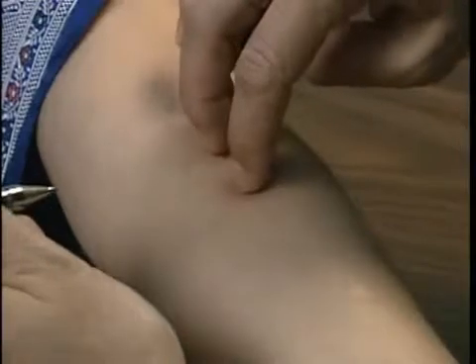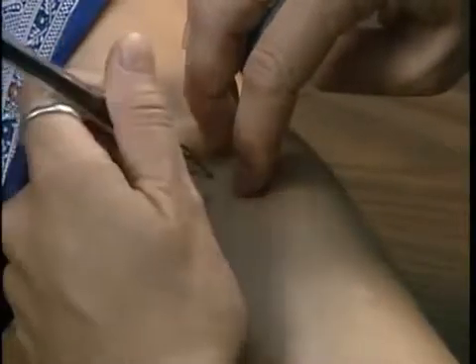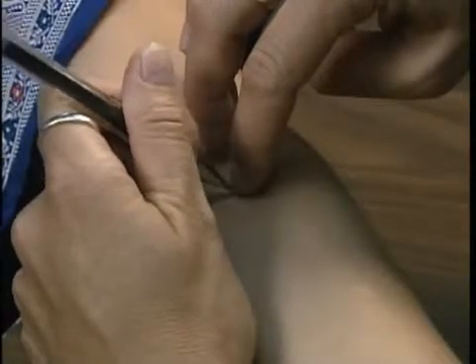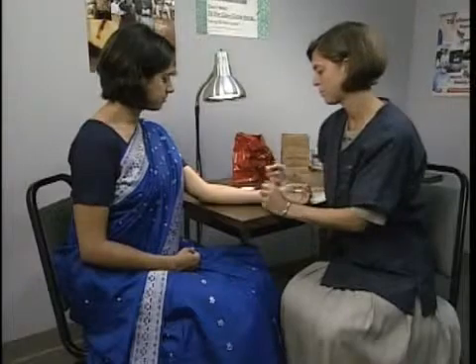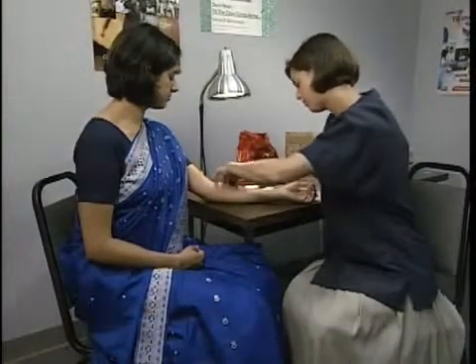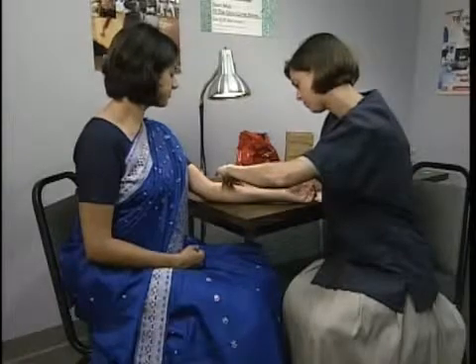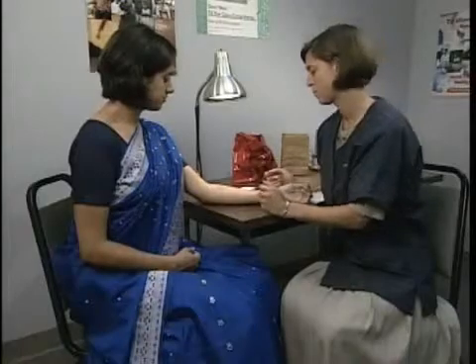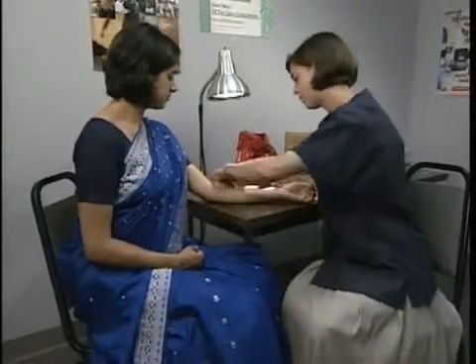The fingertip should remain in contact with the skin at all times. Mark lightly with a fine dot at the widest edge of the induration, using the fingertip as a guide. Repeat the procedure from the other side of the patient's forearm and place the second mark on the margin of induration. Palpate again to double-check that the induration was marked correctly.